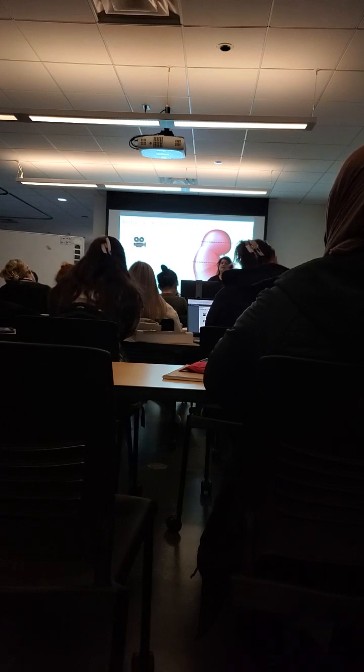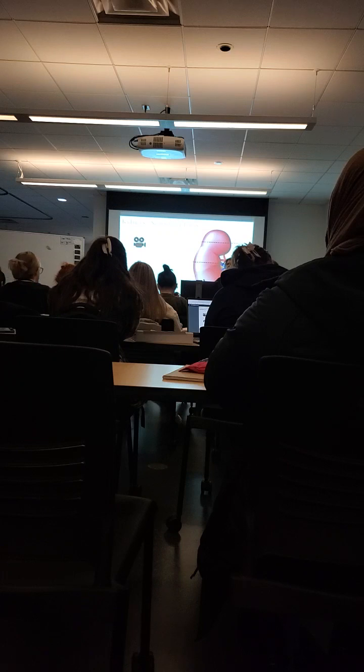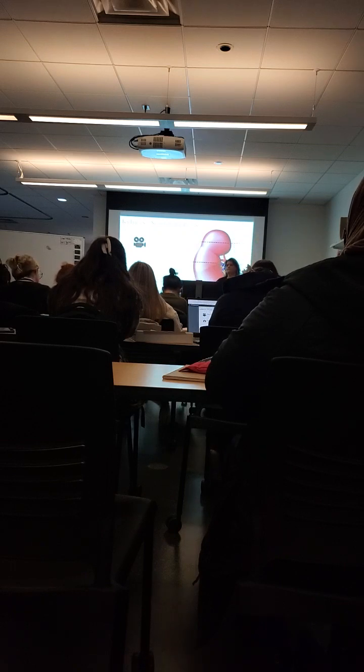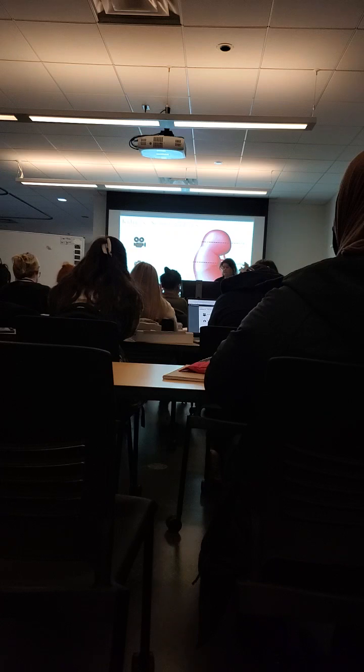That's not a good sign, because if the fluid's backed up in the kidney, then there's something going on between that and the bladder, right? So most likely they have an obstruction, or a stone, or they could have TCC, which is a type of cancer growing in that ureter, or in the bladder. So there's a lot of things that we have to look at. And anytime we do the kidneys, by the way, we always look at the bladder. So we'll be taking pictures of that. We're going to talk about that.